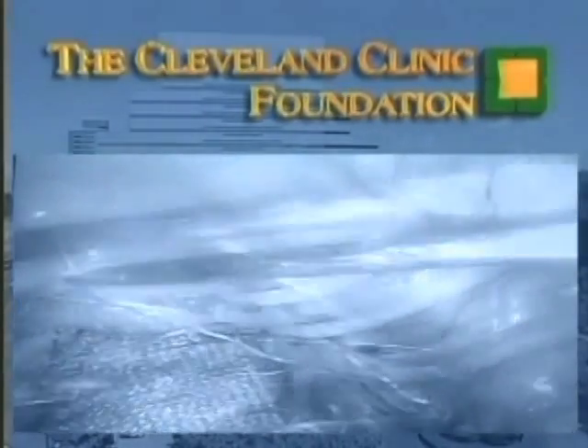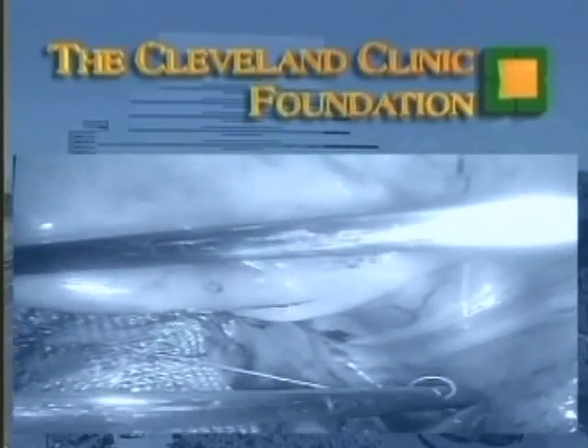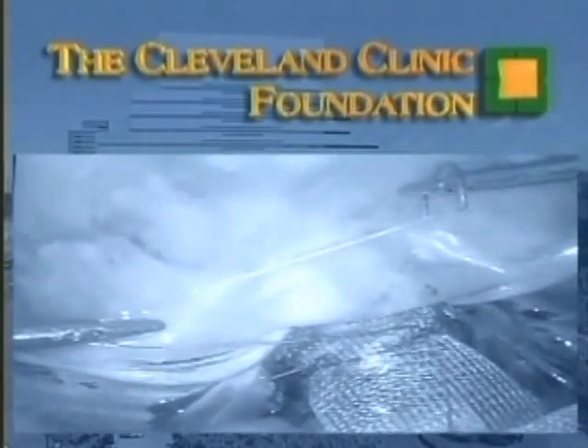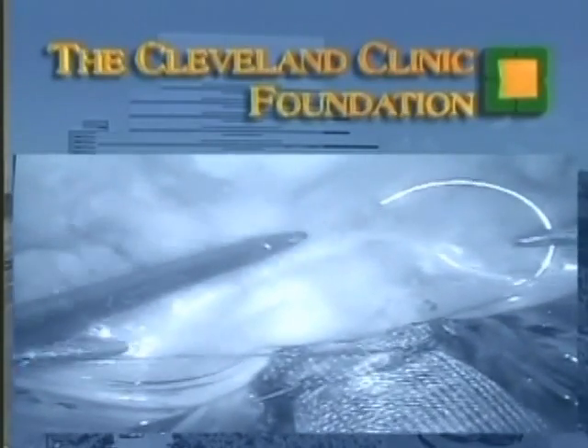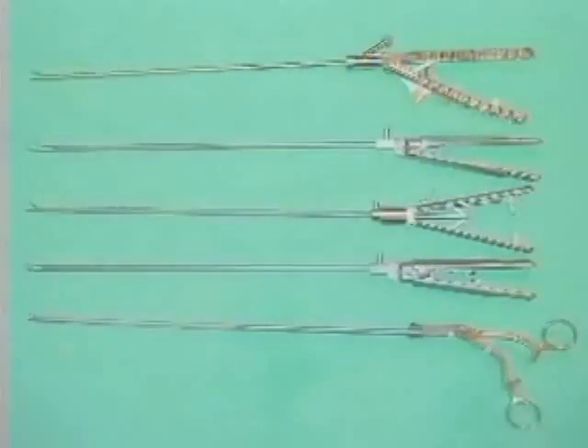We believe that once you master the techniques illustrated here, you'll be able to suture with confidence just as you would in open surgery. We cannot overemphasize the value of practice using a laparoscopic trainer prior to attempting these skills in patients.